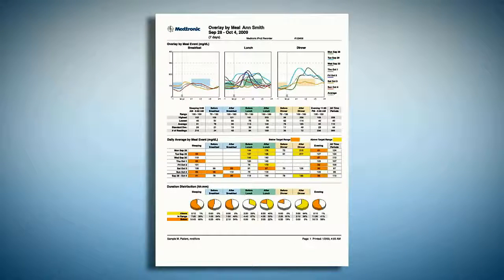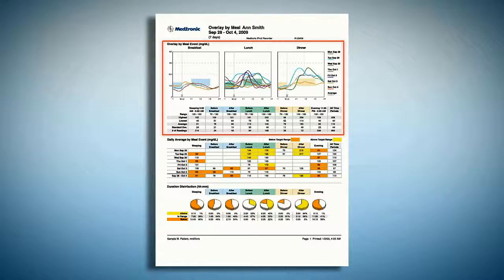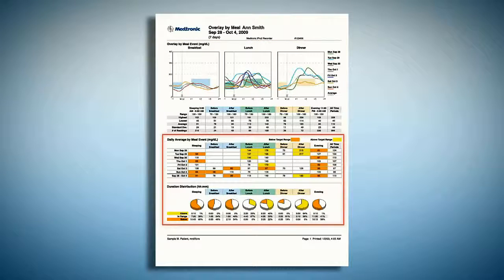The next report is the Overlay by Meal. This report also provides an overlay of the sensor traces from each day of the evaluation; however, these are separated into meal periods. Underneath are similar statistics from the daily overlay, broken up by time of day. This report is a great tool to see patterns related to pre- and postprandial excursions.